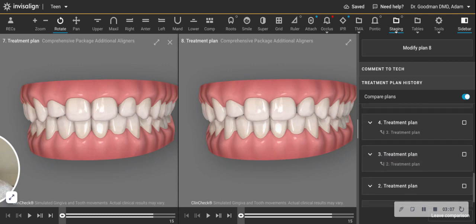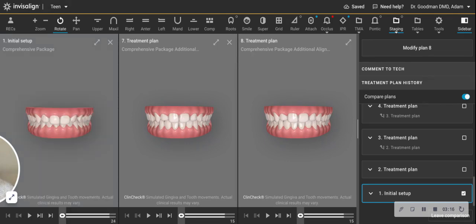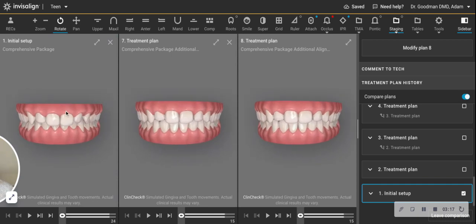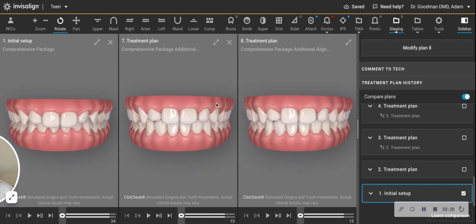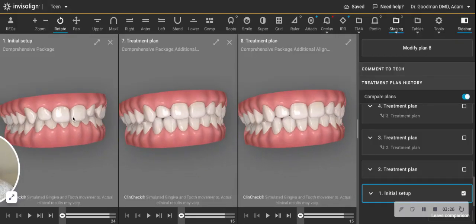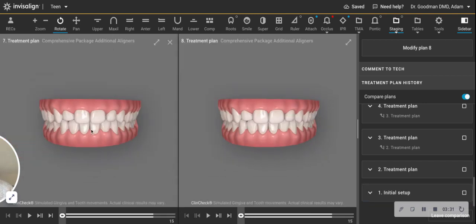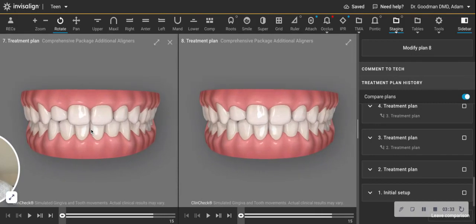I'll even pop back to how we started in this case. There were no spaces at the start, but the bite was very deep — what's called a deep overbite. If you recall, these teeth were coming down. Look at the progress: you can now see the lower teeth, and the upper teeth are not leaning in as much. But if I try to bring them back in further at this point to close the spaces, we're going back in the direction we started.